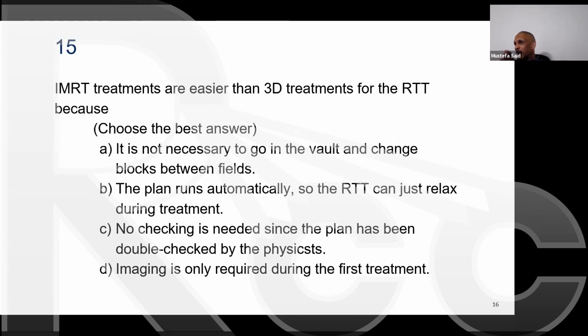I want to address that because collisions happen and patients get hurt when the RTT gets relaxed. When I start the next part of today's program, I'll be talking about the three missions of IMRT and how RTTs go about IMRT. But right now the answer is A, and we are done with this.